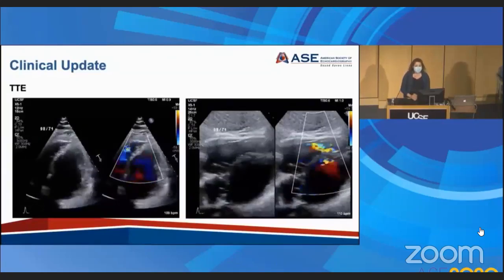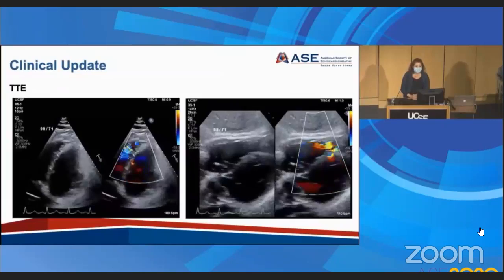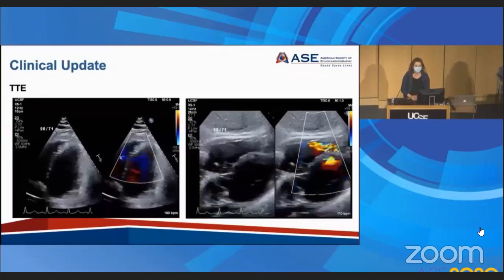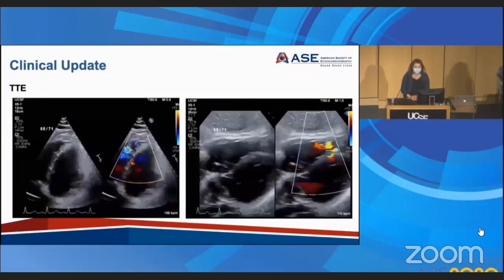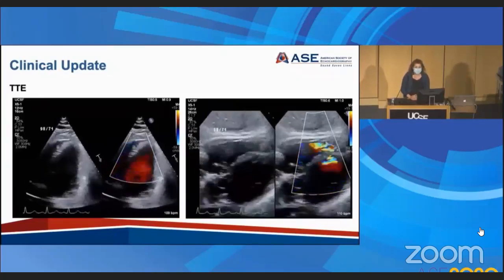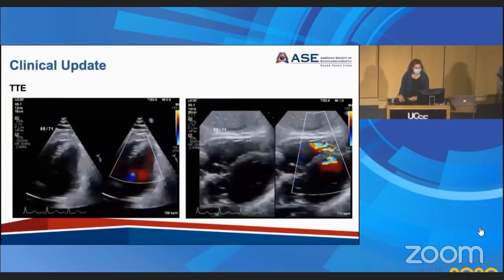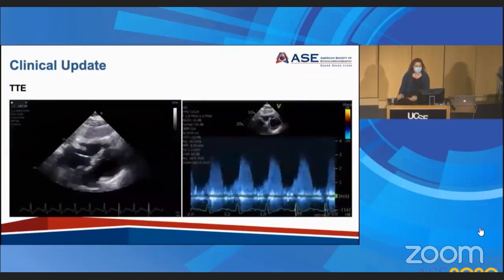Later that day, a complete echocardiogram was performed. Similar findings were noted. Better appreciated is akinesia of the basal to mid inferior wall of the left ventricle and a large ventricular septal defect with left to right shunting across the muscular septum near the apex. Upon further interrogation, the defect was measured at approximately 1.7 centimeters with a peak pressure gradient of 38 millimeters of mercury.